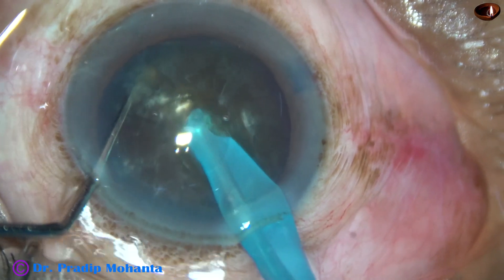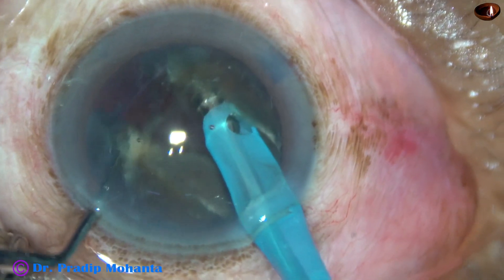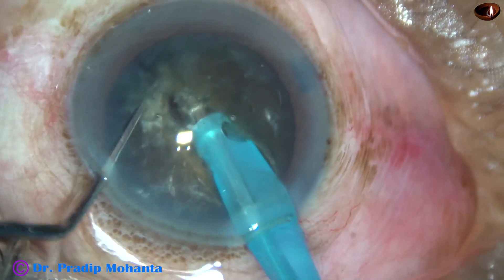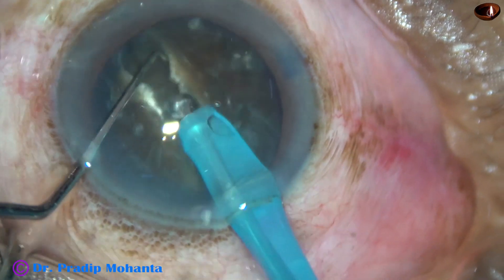The tip goes through the substance quite some distance and goes near the opposite equator, and the nucleus is chopped. A very good crack is obtained.